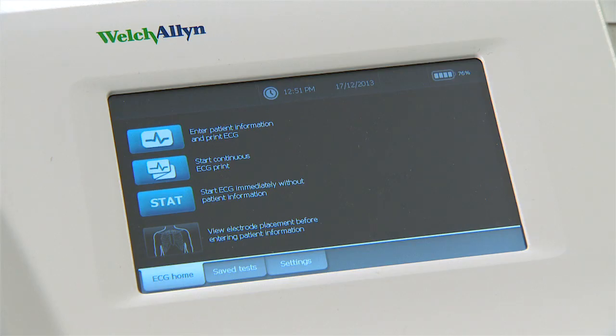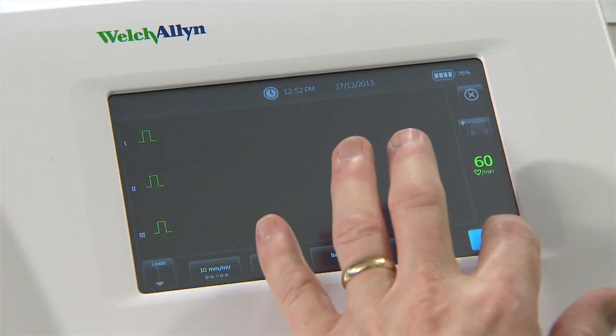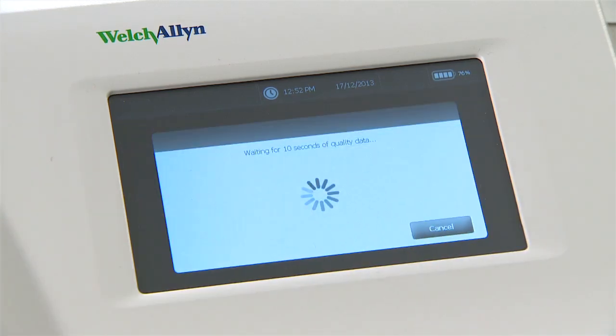To take a stat ECG — that is, start the test immediately without any patient information — choose the stat option in the home screen followed by print. The interpretation on all stat ECGs assumes the patient is a 35-year-old man. Standard auto or stat ECG reports will show all 12 leads, a lead 2 rhythm strip, and an interpretation.